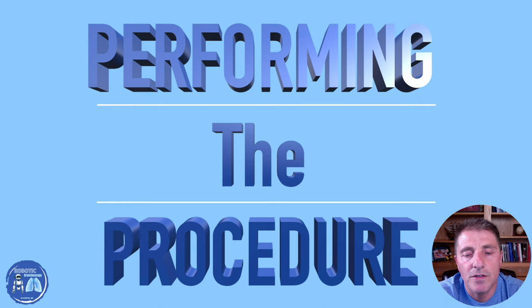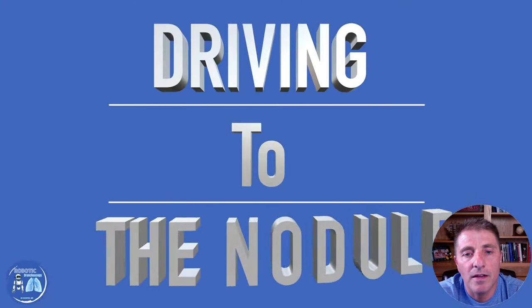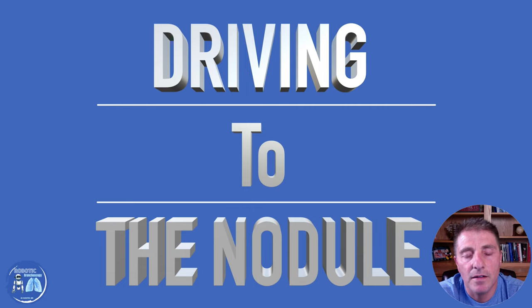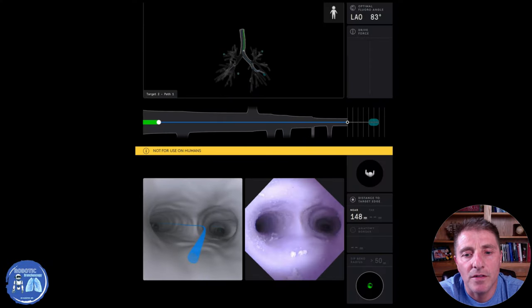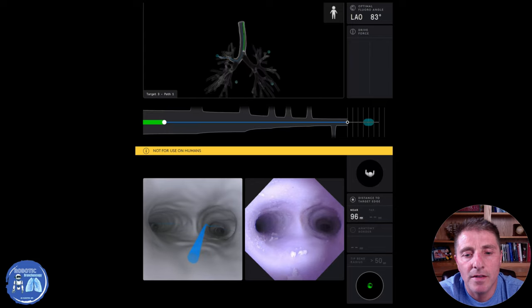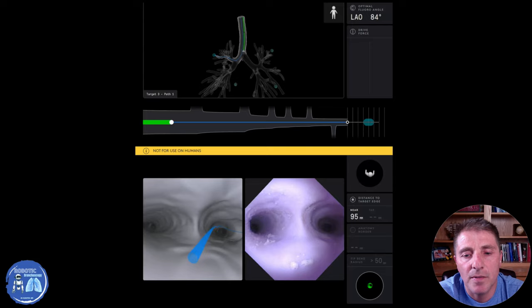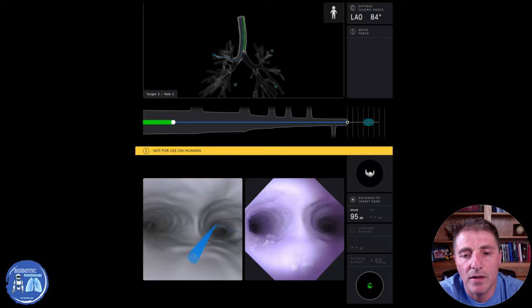When we perform the procedure, we combine both the information created with the virtual model, as you saw, with the real-time airway of the patient. So while we are performing, we can see on the left the virtual map and on the right the real airway. In this example, a silicone model pathway is used to drive through to get to the target.